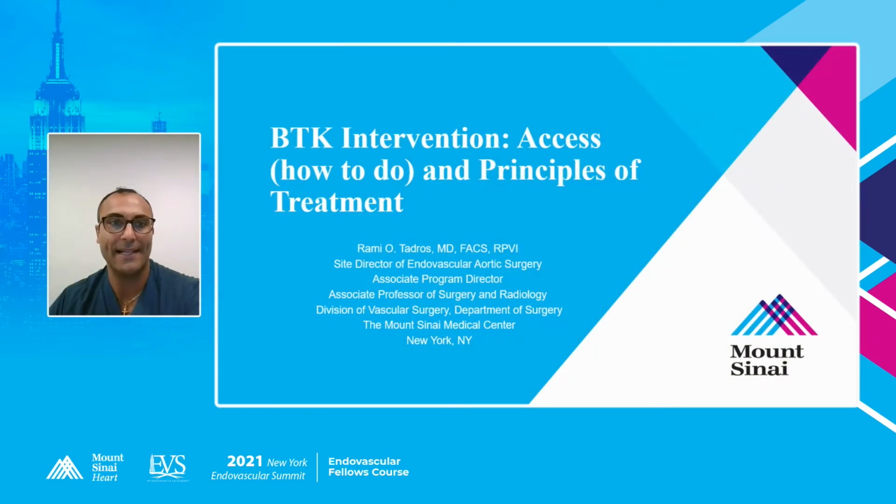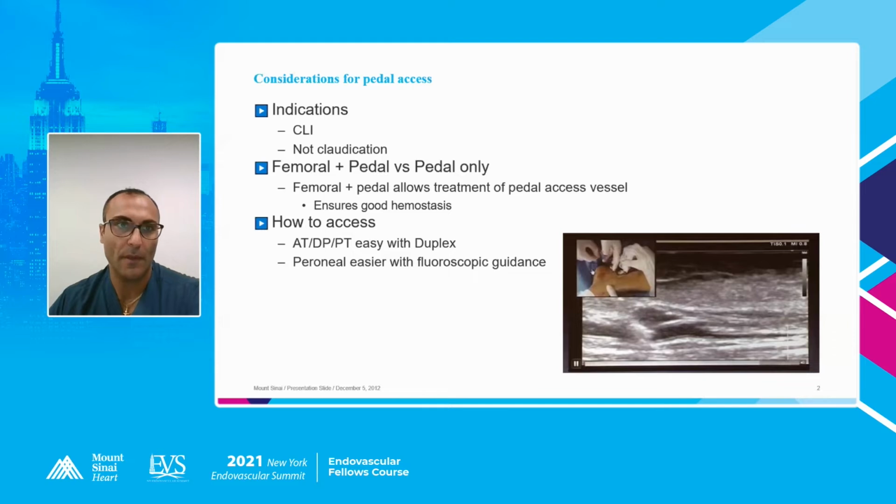I'm going to talk about access, how to do it, and the principles of treatment. So some considerations for pedal access is, number one, I only consider pedal access for critical limb ischemia. It's not something I generally do or consider doing for claudication. I think this is very important. Know your indications.